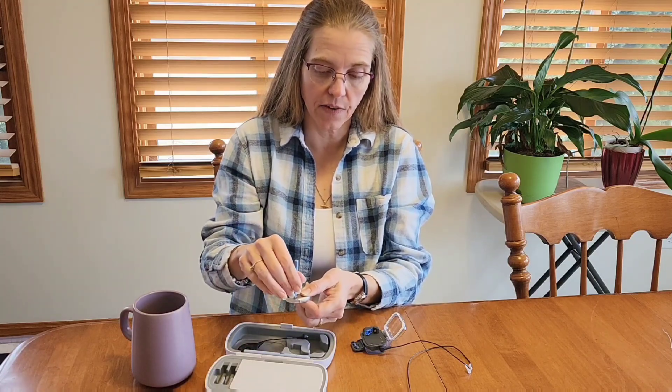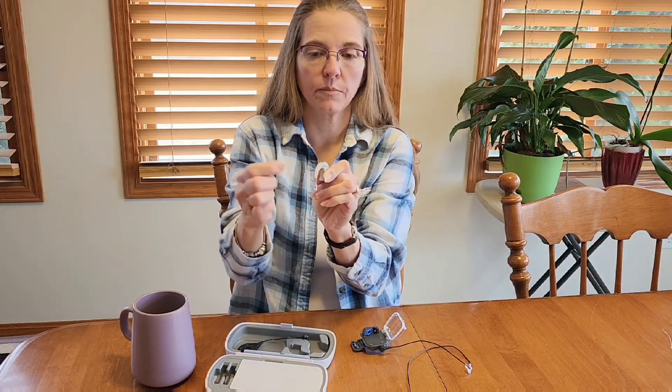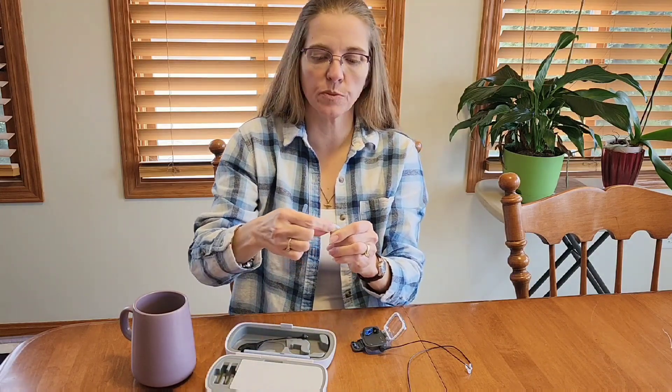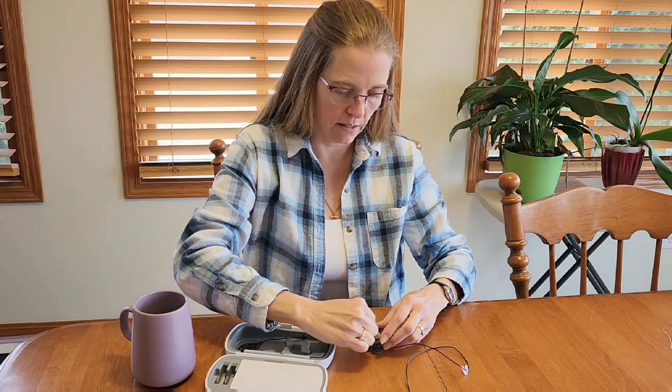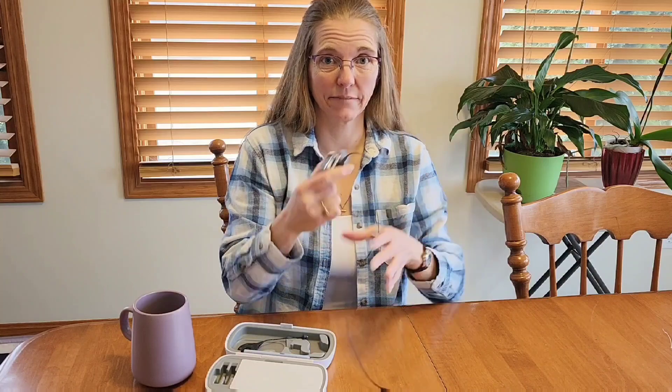I like to do this over a case so that if the pin does fall out, I'm not going to lose it. You're just going to insert the tool as far as it goes — I can't push it out all the way but it's out enough that I can pull the t-mic out — then I just push that pin right back in. And we're done, it's ready to go.